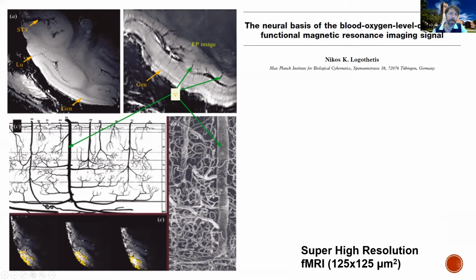This in B is a zoom in the lower right part of the brain, but it has less oxygenation. And indeed, you can see these little black lines all around. See this one right here? All these black lines are nothing but blood vessels.